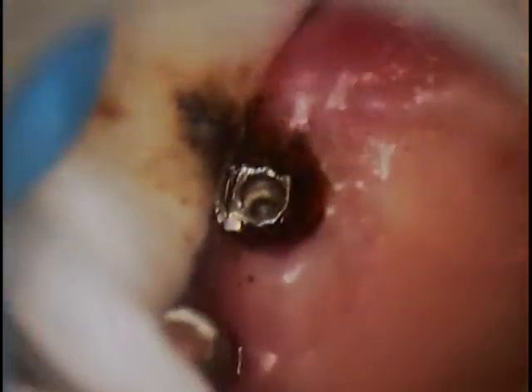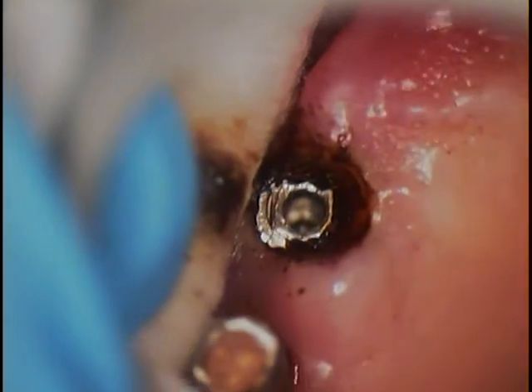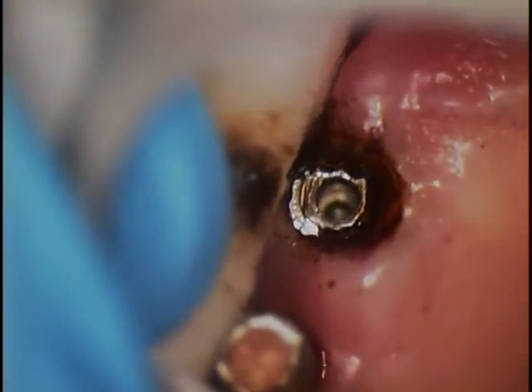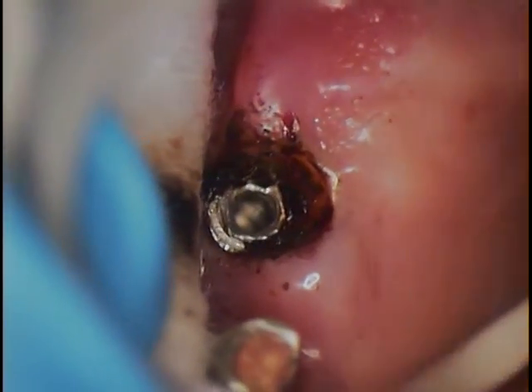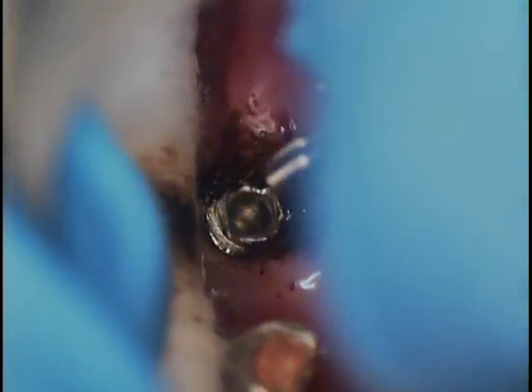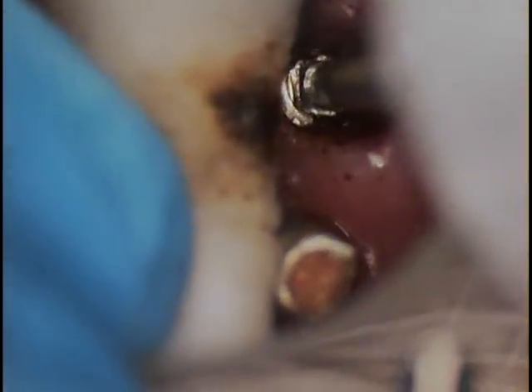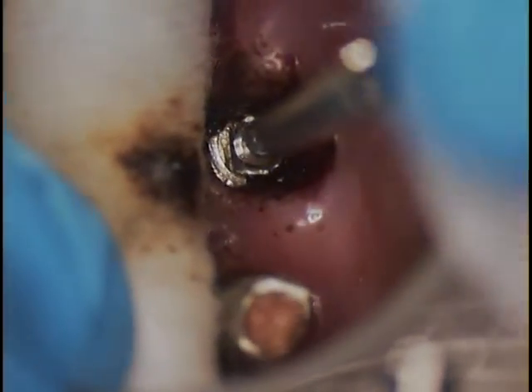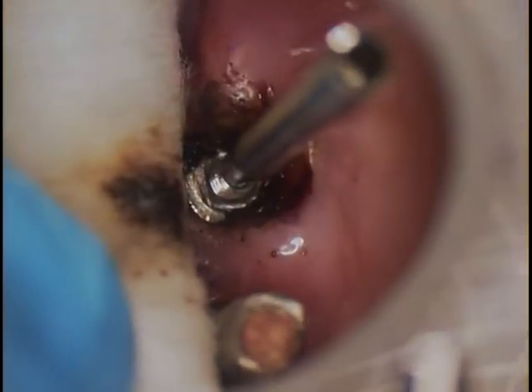Okay, we're back. A lot of progress with this case. The fractured screw is out, and now we're retapping with a normal impression coping screw. I'm cleaning the threads, part B. We did a nice job with the cleaning methods I went over earlier.